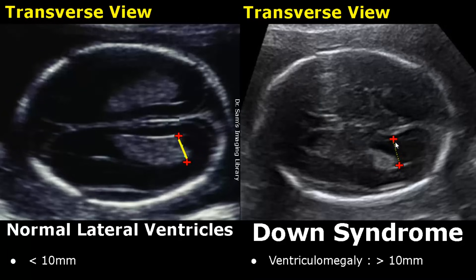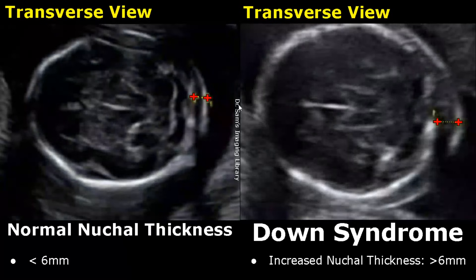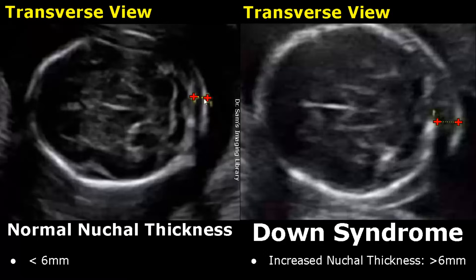The normal nuchal thickness in the second trimester must be less than six millimeters. It can be measured in the transverse view of the fetal brain at the level of the cerebellum. Here is an image of an increased nuchal thickness — we can see an increased measurement — which may be seen in a fetus with Down syndrome.